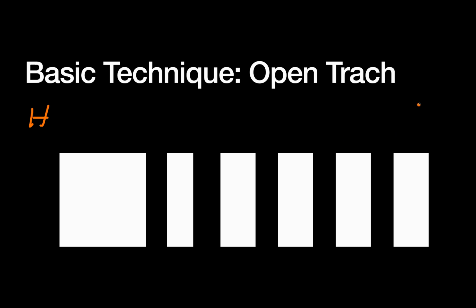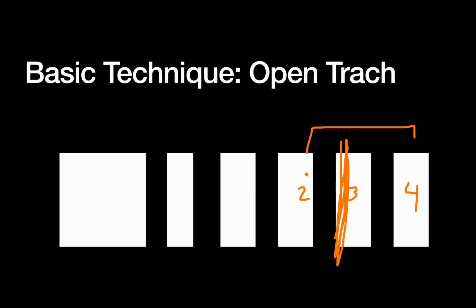So head to foot, thyroid cartilage, cricoid cartilage, tracheal rings. And remember, the tracheostomy, that's all about the trachea. So we're actually aiming for tracheal rings 2 through 4, roughly, as our level. So a good marker for that is to take 2 finger breadths above the sternal notch and to make a horizontal incision at the skin. Then you're going to carefully dissect down to the tracheal rings. Again, aiming for rings 2 through 4. Classically, and we'll talk about this more later, if you go too high, you get subglottic stenosis.